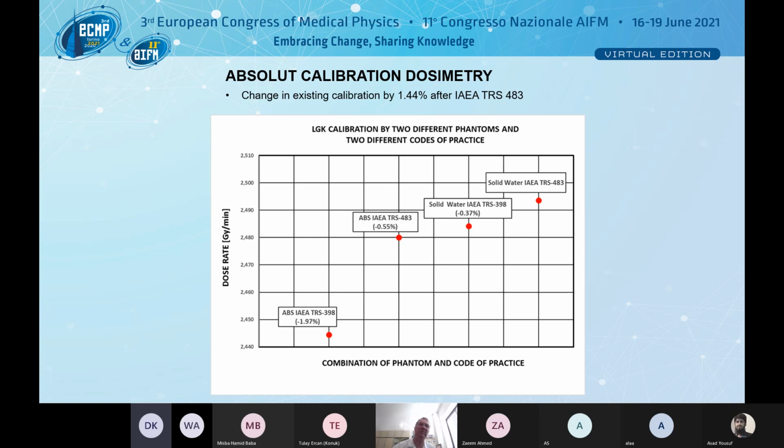Despite we were doing some approximations, they were not as terrible considering you used a correct chamber, but it should definitely be applied. I think we physicists should measure as correctly as possible. The recommendation is here, we can use it. So why not recalibrate your system and make this small tiny change.